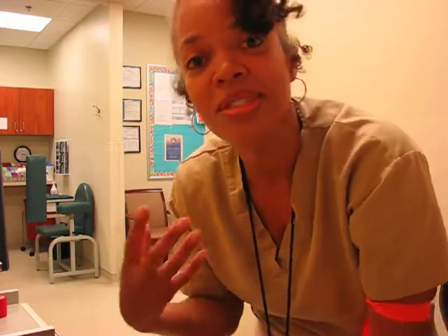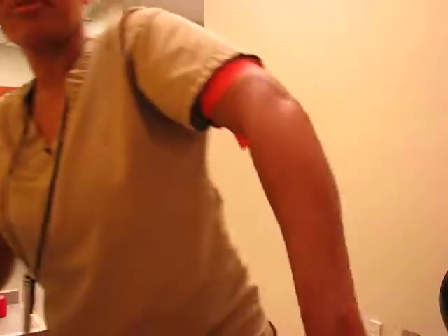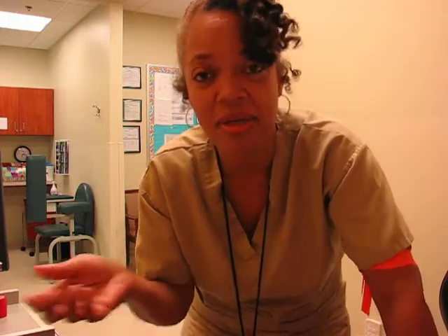You don't want the tourniquet too tight. Another misconception — you've got to really tie that tourniquet tight. This hurts. Practice with the tourniquet on yourself. See what it feels like. If it's pinching or pulling, that hurts a patient. Tourniquet on tight enough for comfort and to get the job done. Sometimes you have to tie it really tight — if the patient says tie it tighter, tie it tighter — but you don't want that on a patient's arm very long.